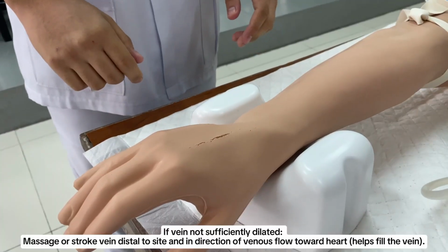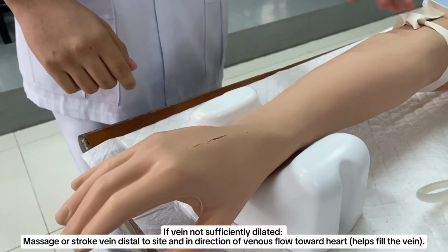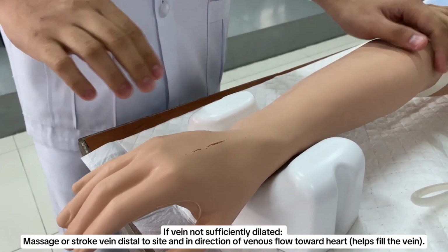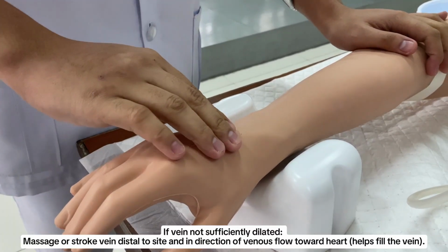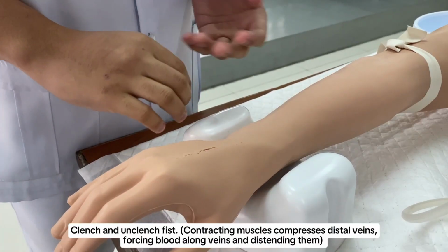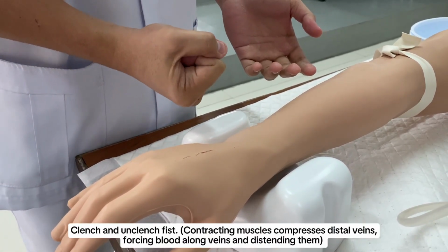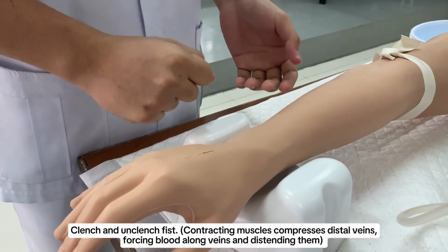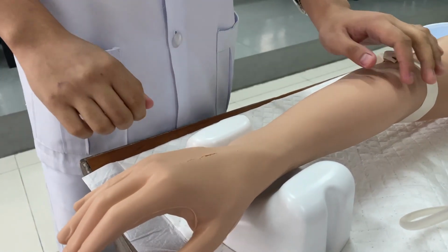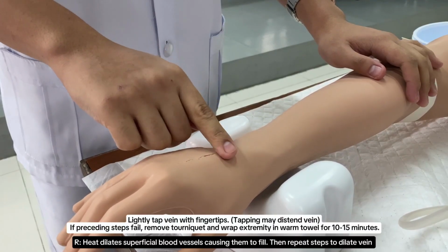If the vein is not sufficiently dilated, massage or stroke the vein distal to the site and in the direction of venous flow toward the heart, because it helps fill the vein. Clench and unclench fist, because contracting the muscles compresses distal veins, forcing blood along veins and distending them. Lightly tap the vein with your fingertips to distend the vein.